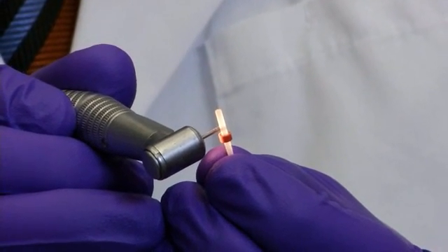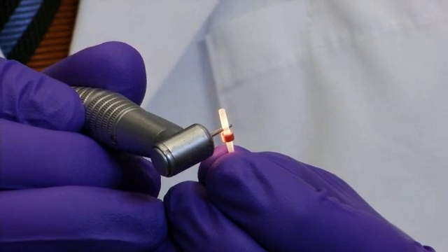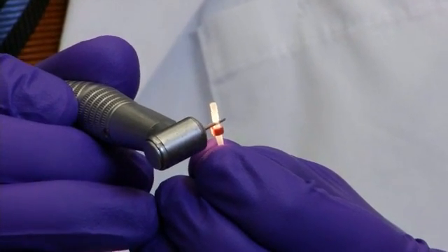Do not use scissors, scalpels, or similar tools, since they will crush the post and ruin the structure and stability.